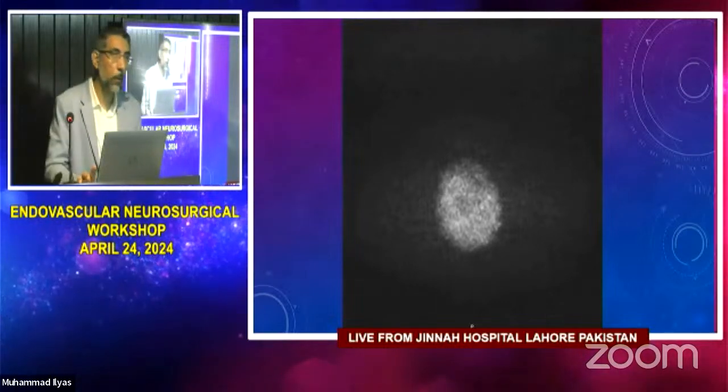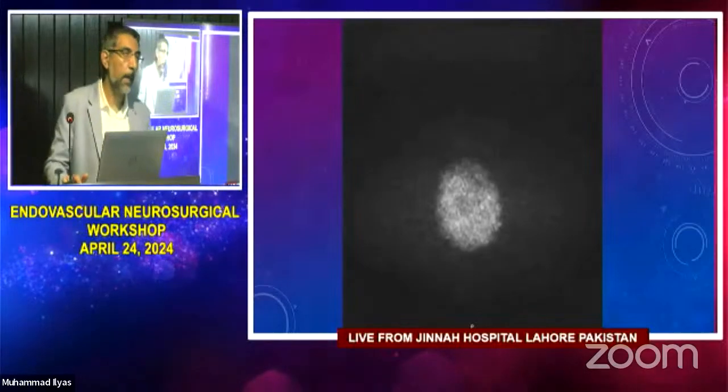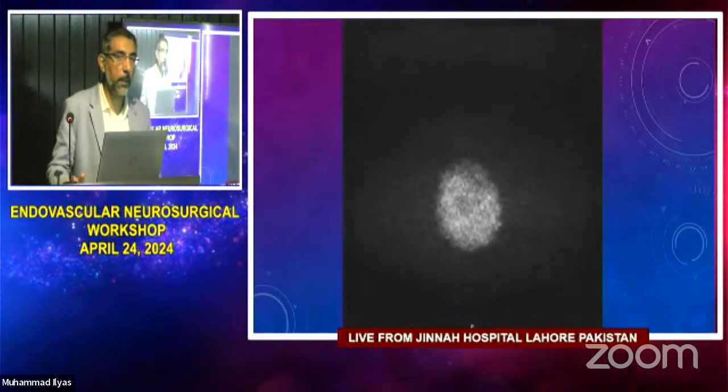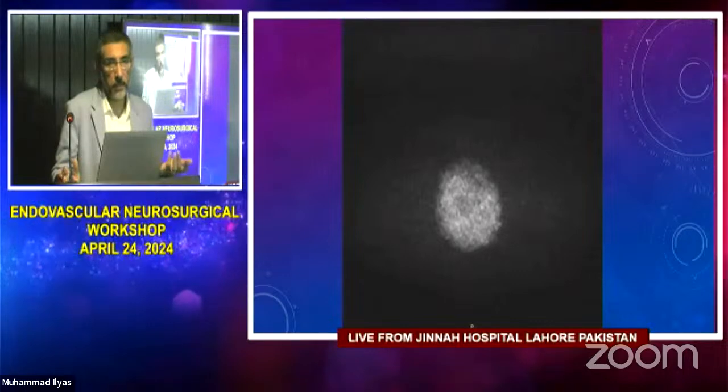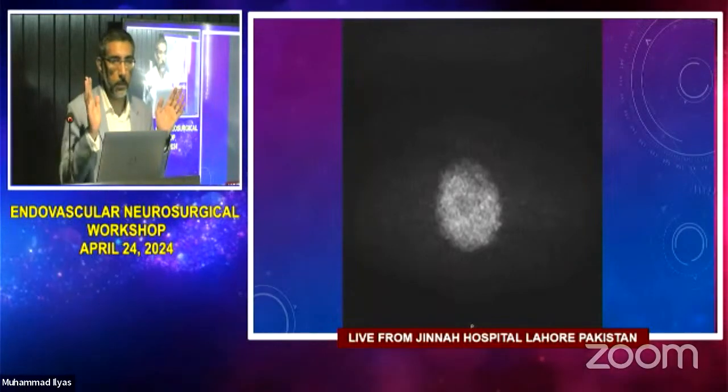So for almost all patients, we will get a CT scan, a CT angiogram, and a CT perfusion. But the CT perfusion has problems with it, right? If the patient is moving all over the place, which these stroke patients are, it's very sensitive to motion. If the patient moves even a little, the whole study is bad.